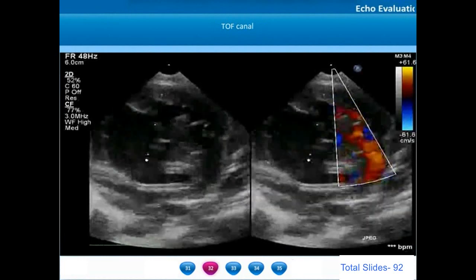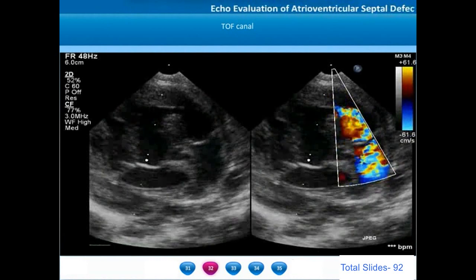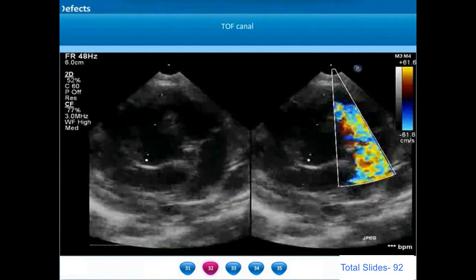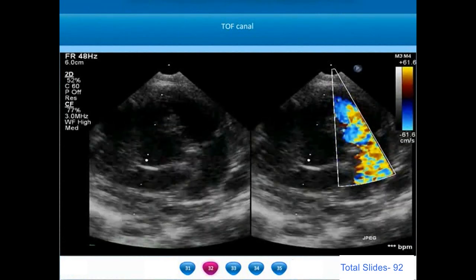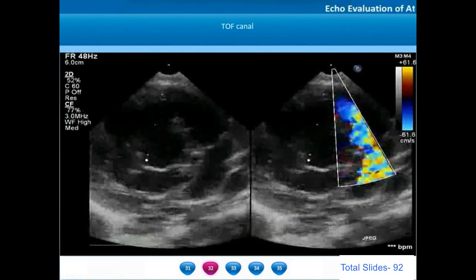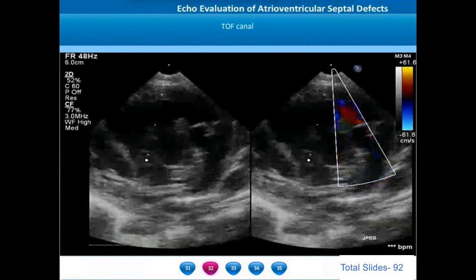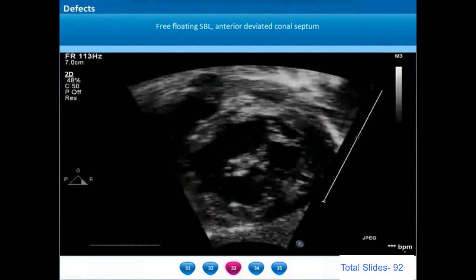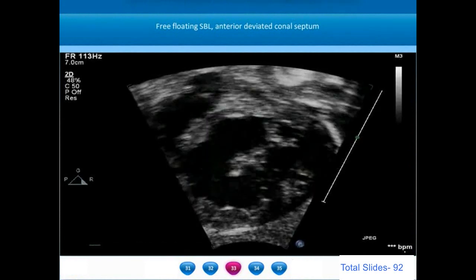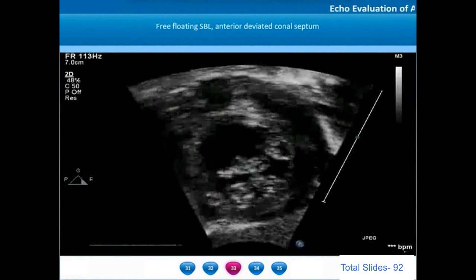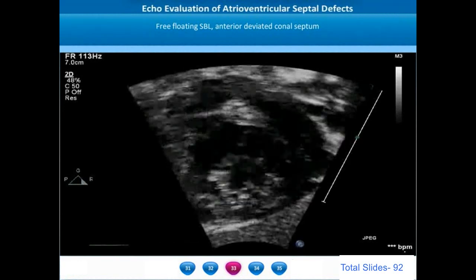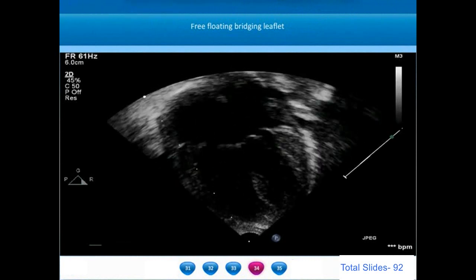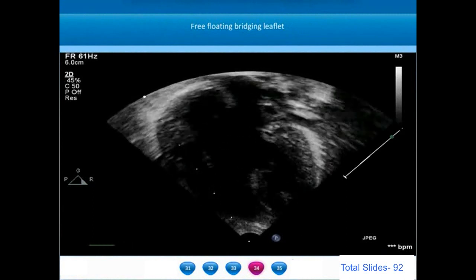In the same example, there was an anterior malalignment of the conal septum like a tetralogy of Fallot. The anterior malaligned conal septum caused a right ventricular outflow tract subvalvar gradient. There is mild doming of the pulmonic valve and the main pulmonary artery is not very dilated. On short axis view, the two bridging leaflets are very large, with the large superior bridging leaflet overhanging the entire inlet VSD. There is an anterior deviation of the conal septum. Bridging leaflets typically have no cordal attachment to the interventricular septum in Rastelli type C defects.